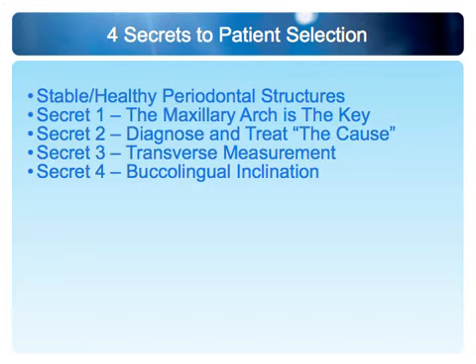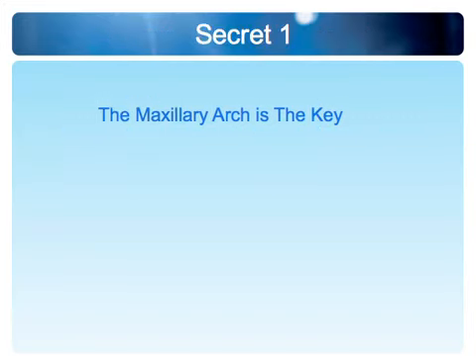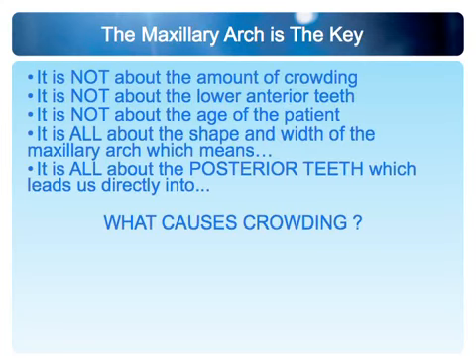Alright, let's move forward. Secret number 1. Let's focus on the maxillary arch for a minute. So for me it really determines how the entire case is going to run. What is the maxillary arch doing? Okay, it's not about the amount of crowding. I spend very little time focusing on the lower anterior teeth.